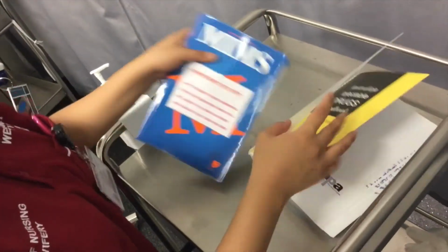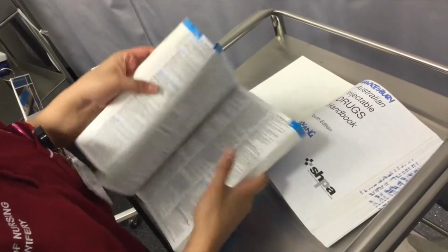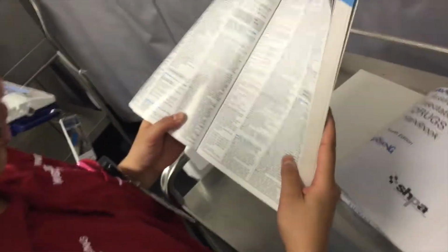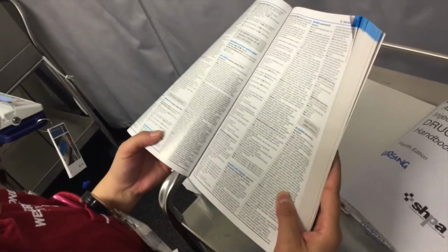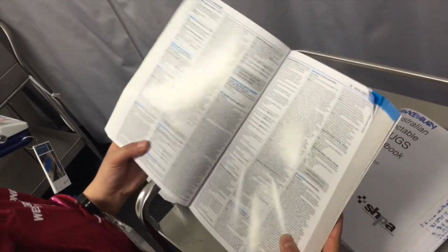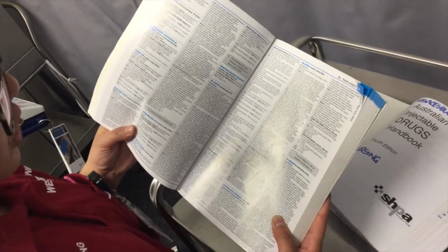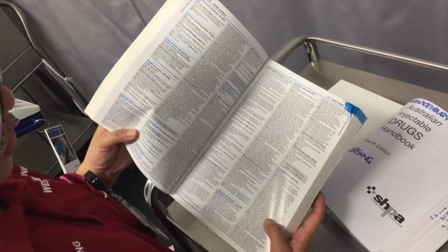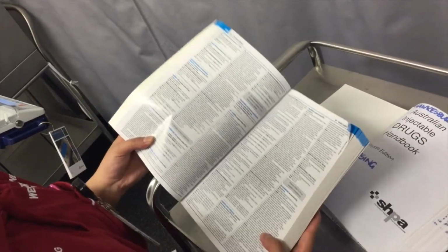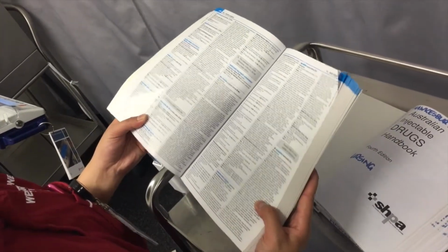On the MIMS, it states that some adverse reactions can be circulatory depression, hypotension, GI upset, and sweating. I know that I don't exceed the dosage for morphine, which is 20 milligrams. So I know that it's okay for me to give it to the patient as well.